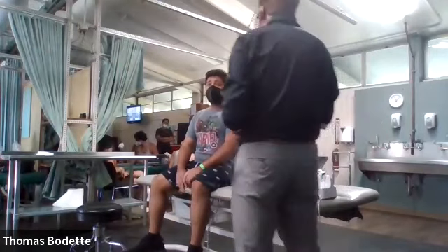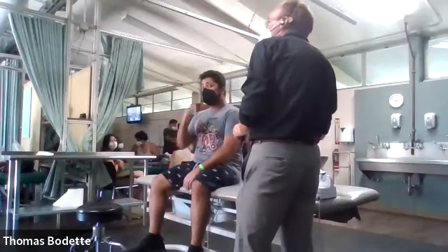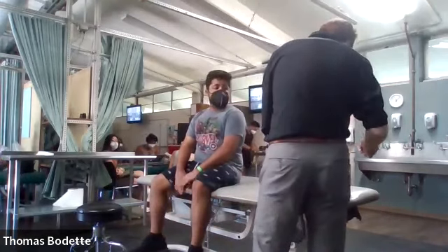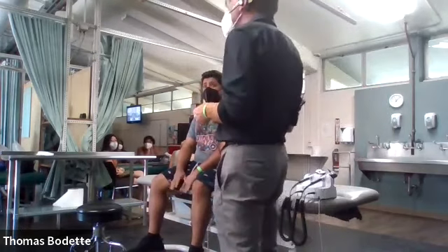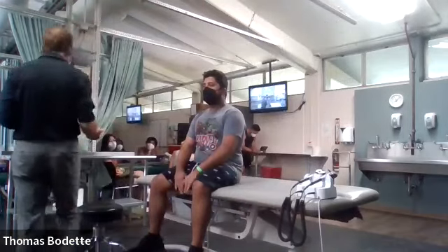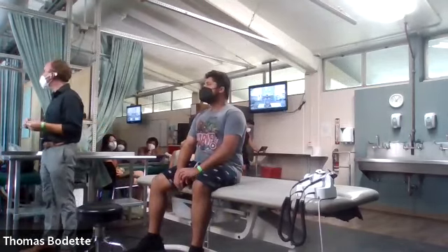Gonna go ahead and clean it in front of you. Okay. Nasal palpation and rhinoscopy. I would get into the habit of not only palpating the nose before evaluating it, but I would also get a sense on whether or not there might be any possible obstructions before inserting the specula. So here are some strategies with which to do that.